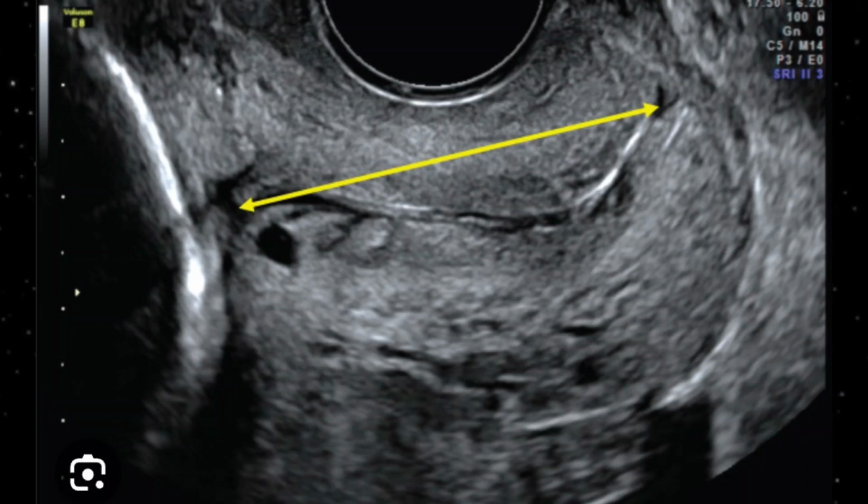Here on this image, it is clearly shown how you will take the length, because length is very important. Because of the shortness of the cervical length, there is a likely possibility that, because of the pressure of the fetus, this may get enlarged, this may get dilated, and abortion ensues. So always take care of cervical length, which is by far the most important in case of cervical incompetence.